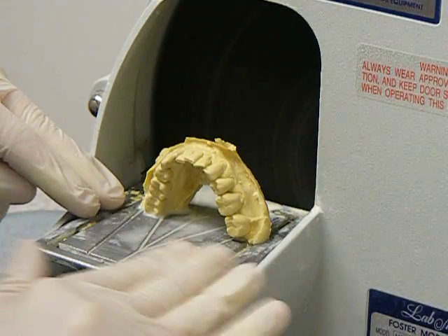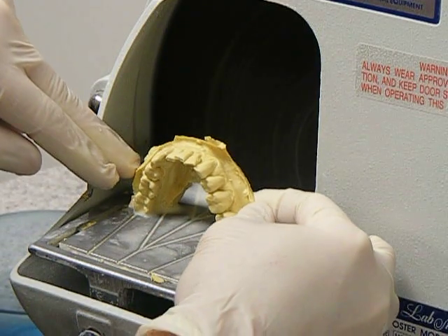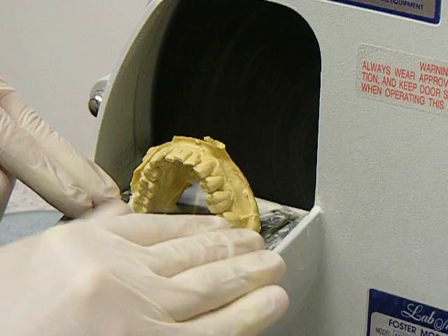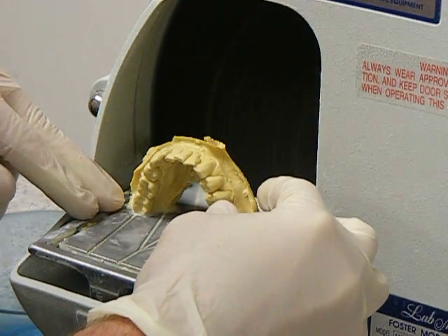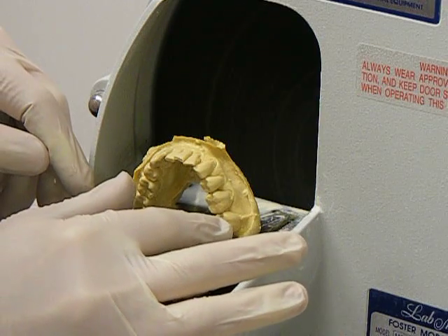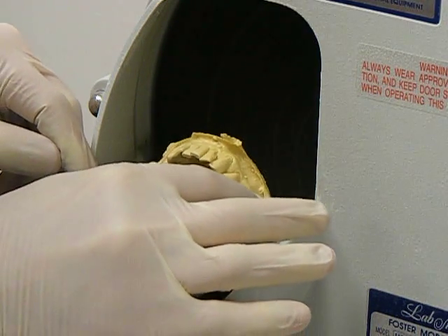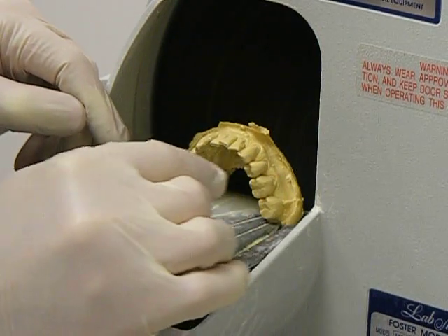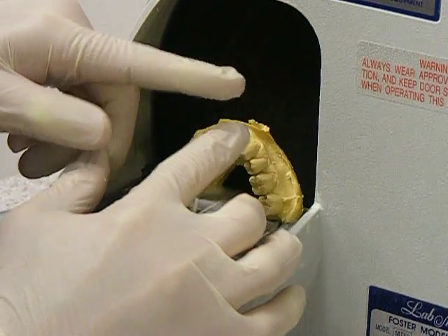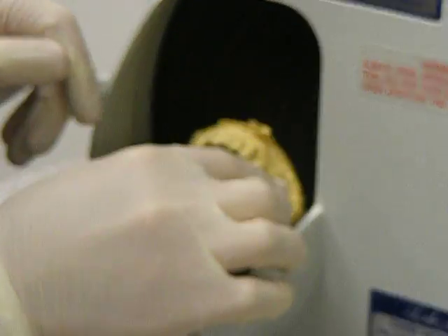Laying it on the grinding table provided with the grinding disc or machine, make sure that it's standing up and that it is even. Place your fingers on the occlusal surfaces of the teeth, then advance the model towards the disc to grind the bottom portion of the model. Your gloves should be fairly tight and not loose, so as not to get caught between the table and the grinding wheel.